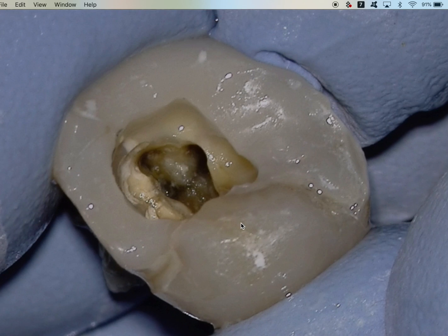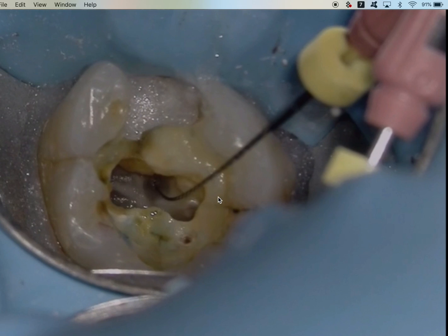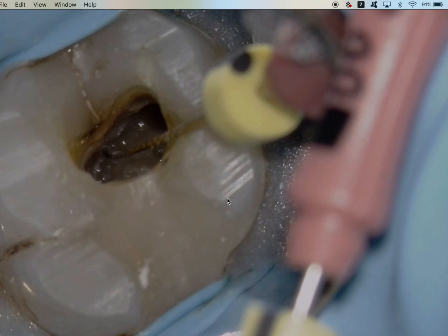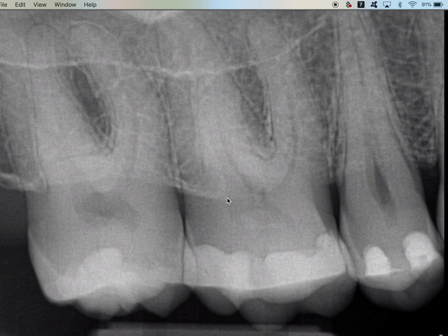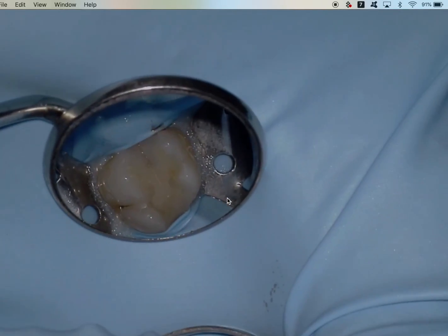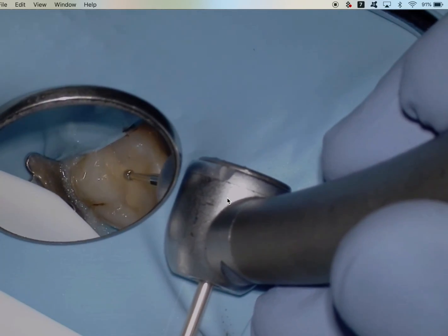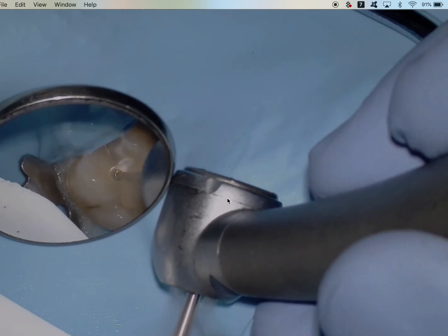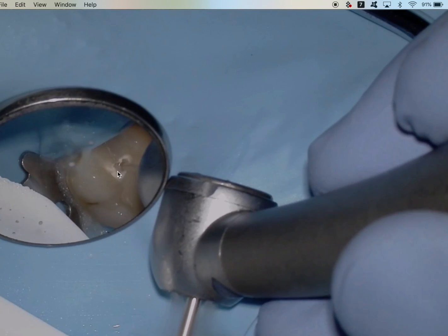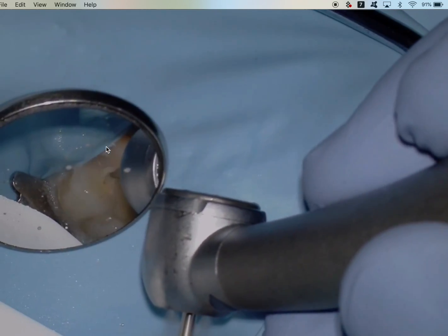This is an extracted tooth we'll have a video on. Here's another MB2 — this is just the initial stage of getting files into it, and I really want to show you how I've troughed for these. This case presented with symptomatic irreversible pulpitis to the maxillary first molar, and I want to walk through a shortened version of the access. You can see right here there's a crack in the composite restoration, and as we access into this tooth there is a larger crack that goes down to the floor of the pulp chamber.